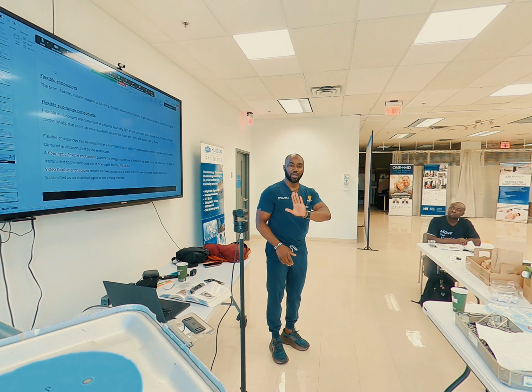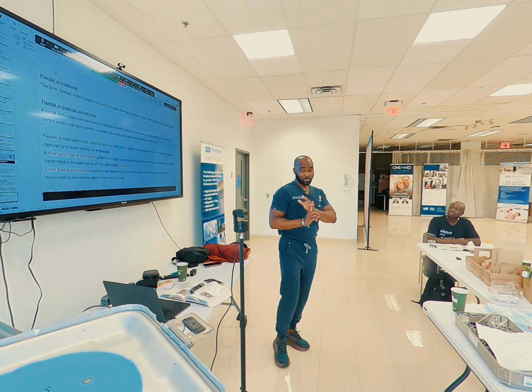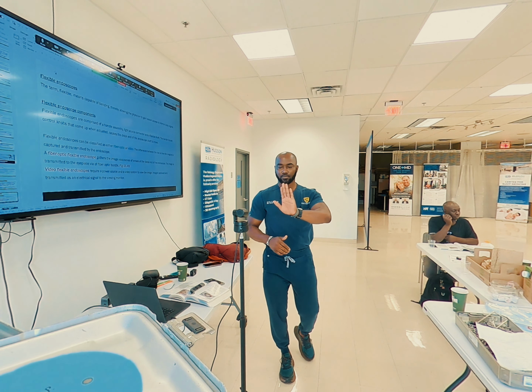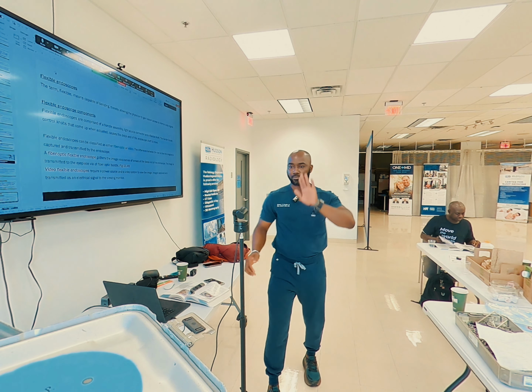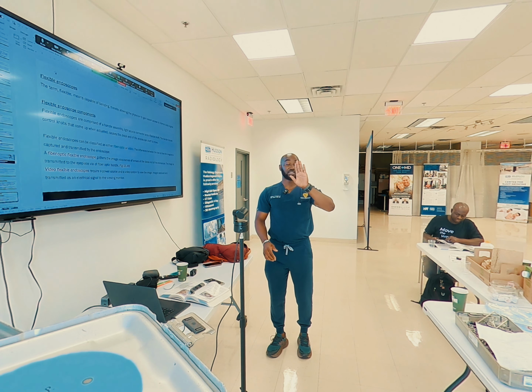What is the minimum requirement for disinfection or sterilization? High-level disinfectant. Yes, high-level disinfection is the minimum requirement for semi-critical devices.